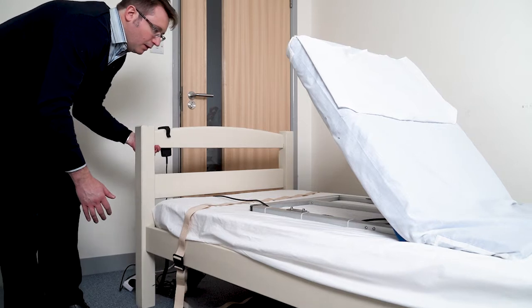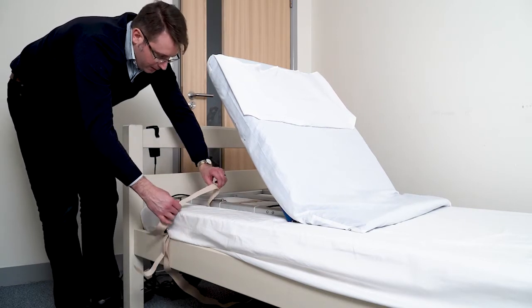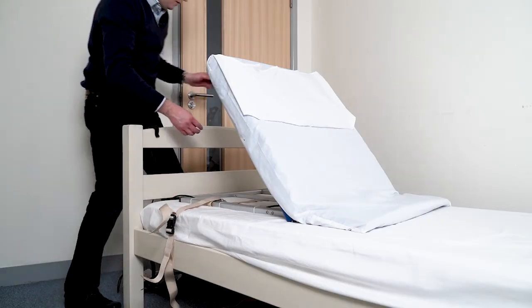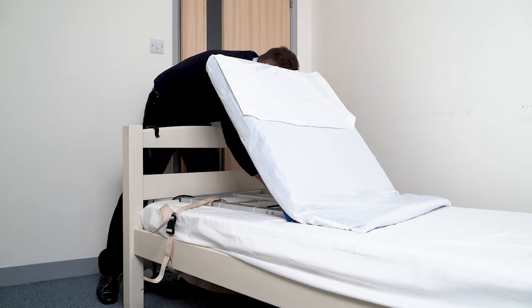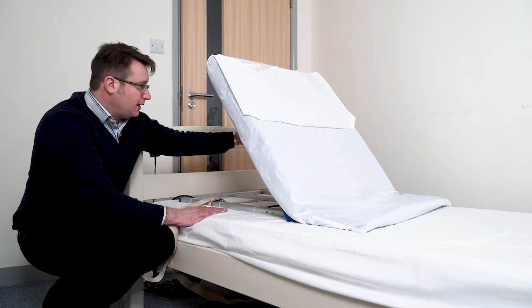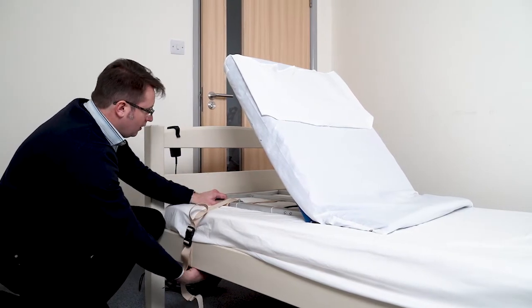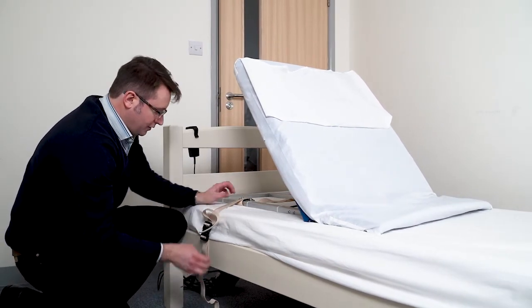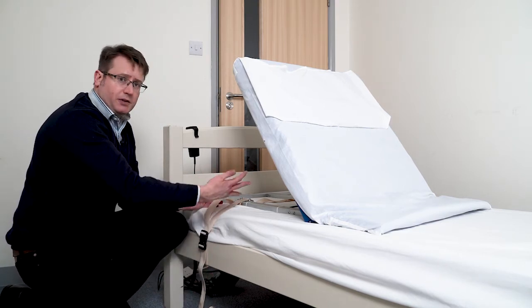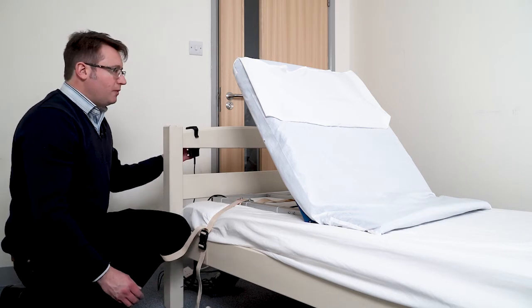And then what I'll do is I'll lift the PillowLifter back onto the loose strap, and then if I pick up one side, I can then feed the strap through the cleat and back down at the side, and I'll do the same thing on the other side. By doing this, it means the strap doesn't come across the centre bar, which would compromise the cam aspect of the pillow lifter at the back. Once I've done that, I would simply tighten up the strap until I've got a secure fitting. I prefer to keep the buckle at the side of the bed so that it's accessible if someone does want to take it off to change a sheet, but I'll tell you a workaround about that anyway. For the time being, I'll just lower the backrest back down.